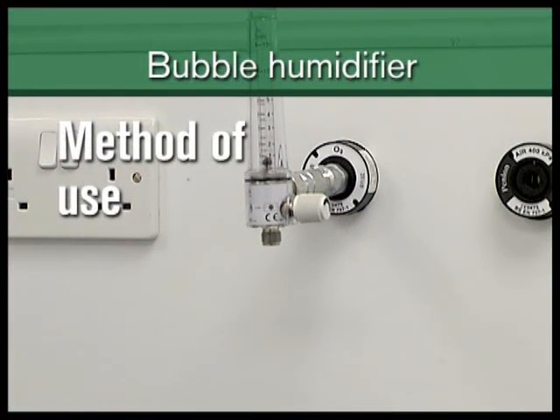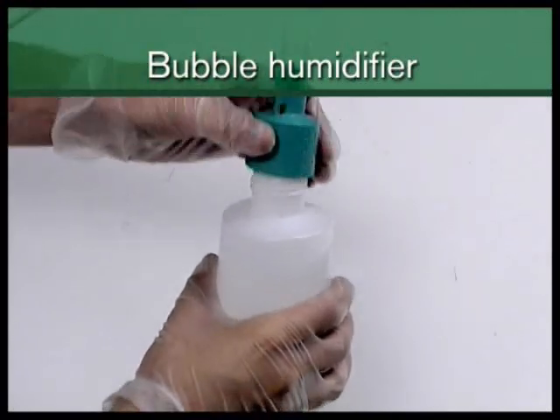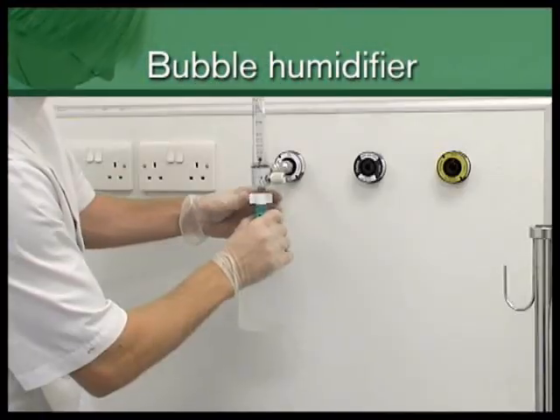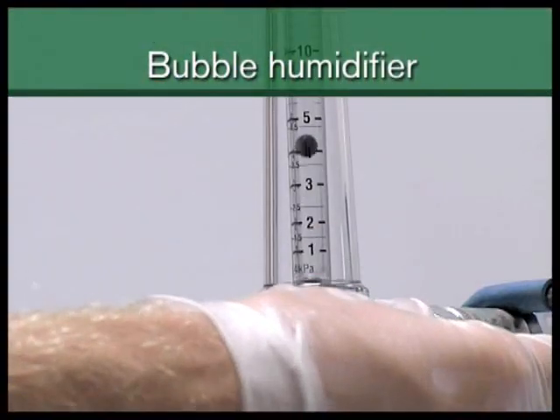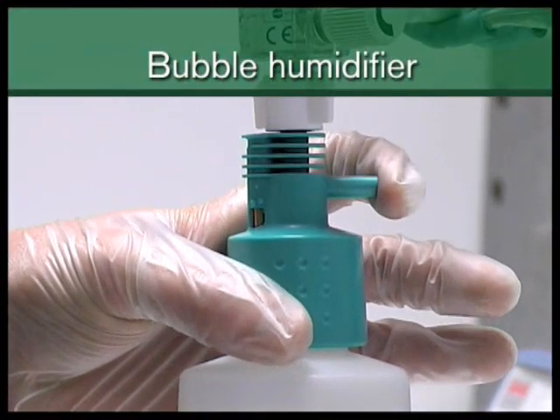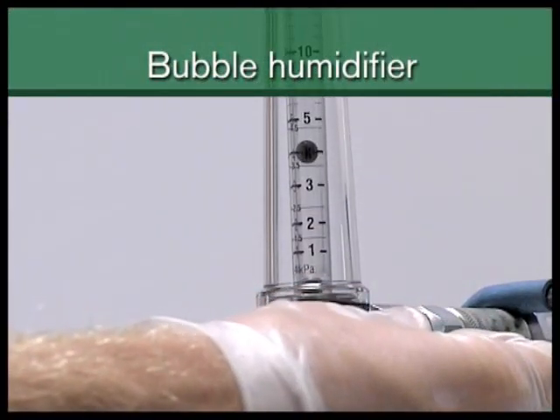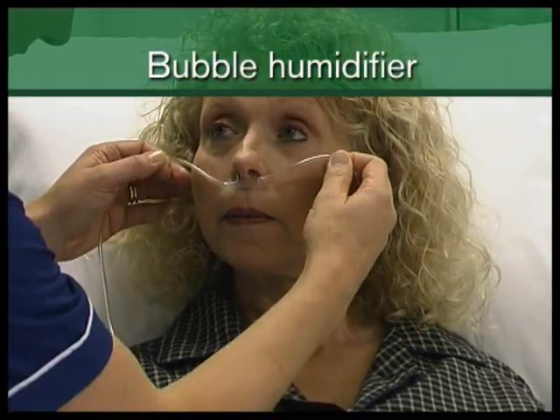The flow meter should be attached to an appropriate oxygen supply. Fill the bottle with sterile water using an aseptic technique and fit the humidifier head, or fit a pre-filled sterile water bottle. The humidifier should then be attached to the flow meter. Adjust the flow meter to 4 litres per minute and occlude the outlet. Verify that the relief valve operates within 5 seconds. Reset the oxygen flow meter to the appropriate flow for the patient. Attach the delivery device and fit to the patient.